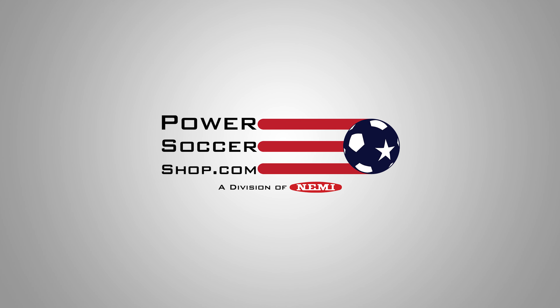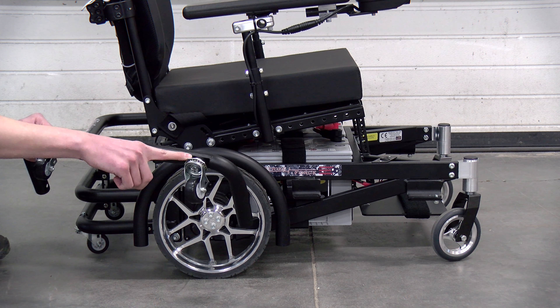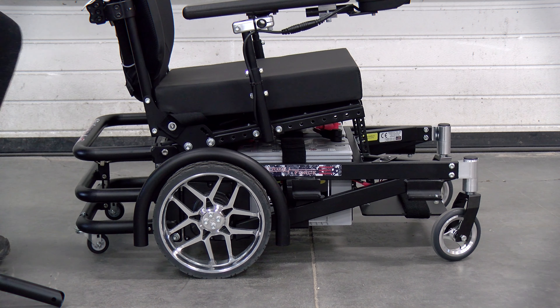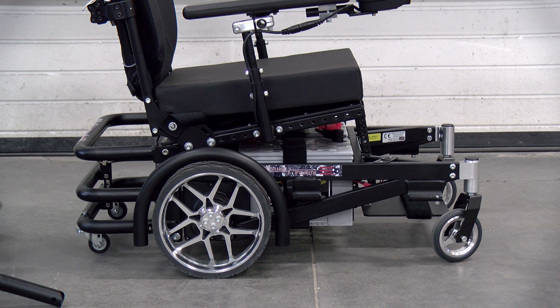Hello everyone and welcome back to another Power Soccer Shop tutorial. My name is Reed and today we're going to be adding washers to the rear anti-tip bar of the Strikeforce to help prevent the chair from tipping back during gameplay and to help you feel a little safer on the court. As you can see, this chair can tip back and forth quite a bit, so we're going to add two washers to each rear caster to see if that helps.